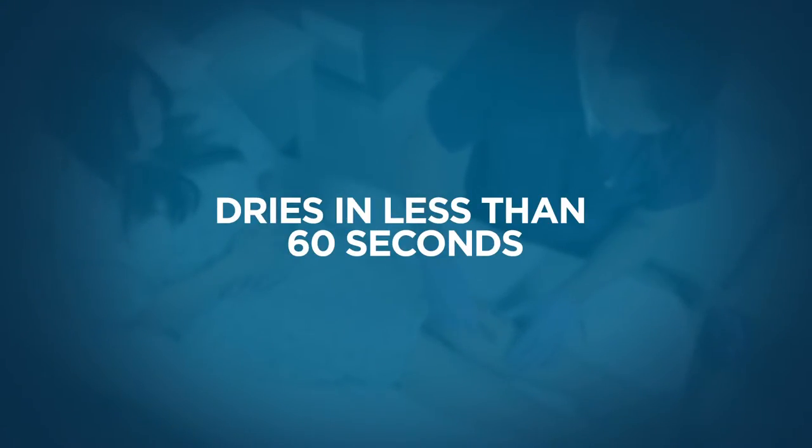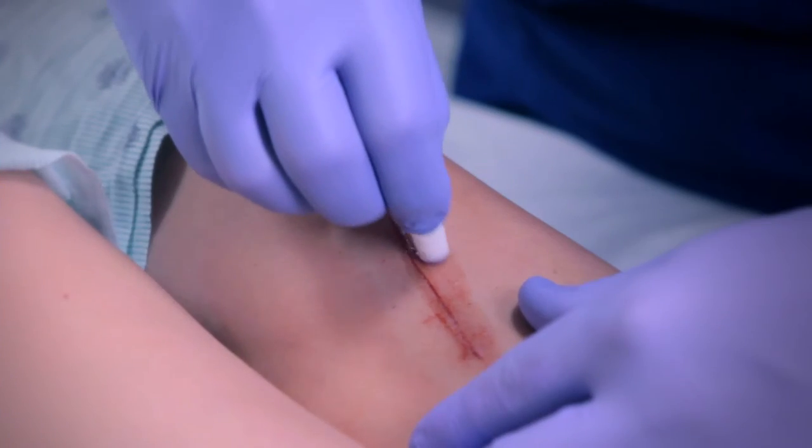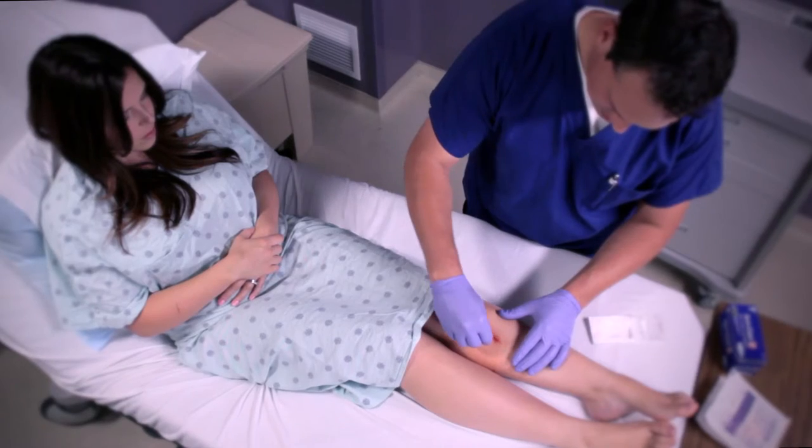Applied correctly, Sure Close 2 will polymerize on the skin in about a minute and it requires just one coat of adhesive to be effective.